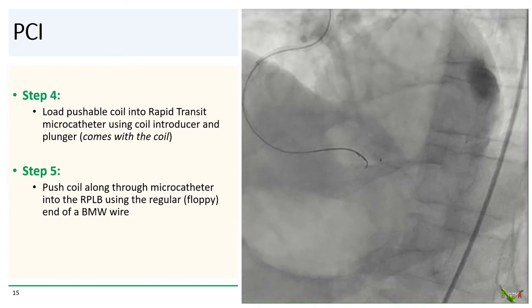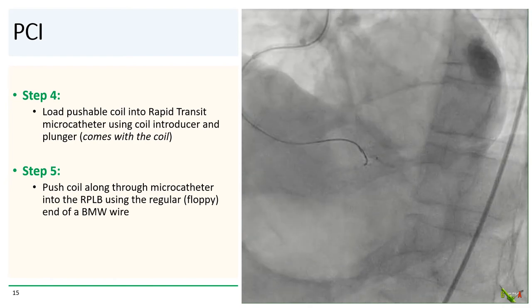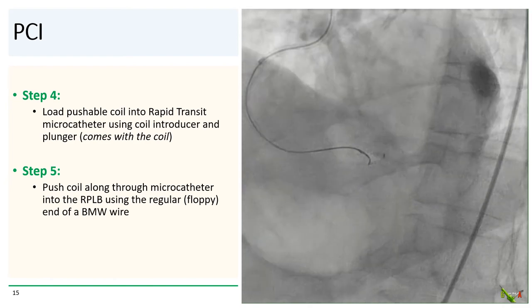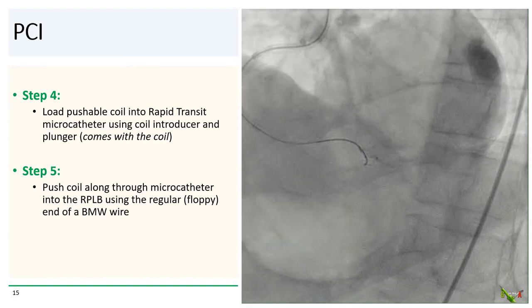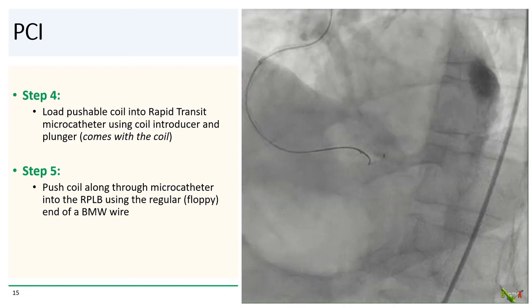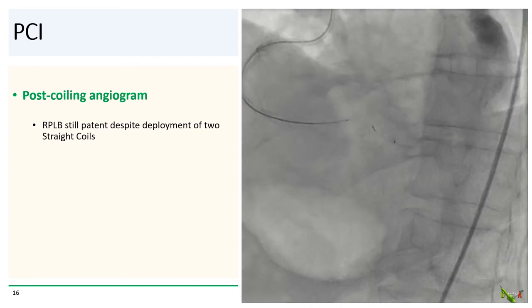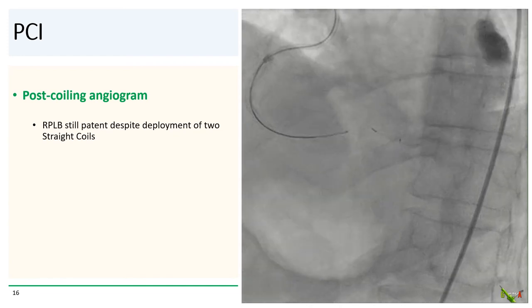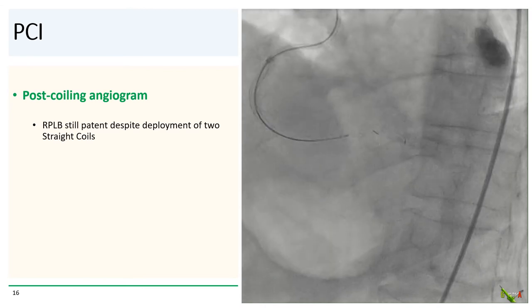Step four: we loaded the pushable coil into the Rapid Transit using the coil introducer and plunger. Finally, we pushed the regular front end of the BMW into the microcatheter to push the coil along into the RPLB. Here is an image of the coil pushed out into the PLB by the end of the BMW wire. Unfortunately, the RPLB was still patent with persistent extravasation despite the deployment of two straight coils.